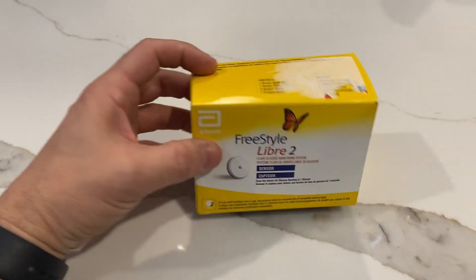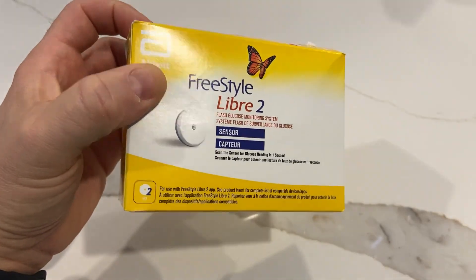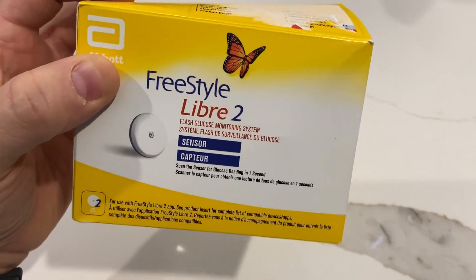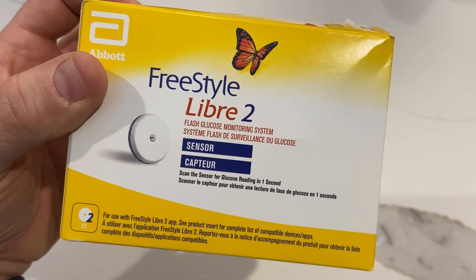Hi folks. This is a Freestyle Libre 2 sensor. I've got my hands on one because it's interesting to see the electronics. Let me explain to some of you what this is in case you're not sure. It's a continuous glucose monitoring system, or as it says, a flash glucose monitoring system.